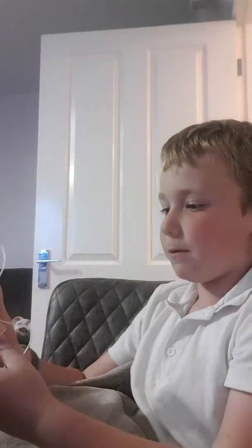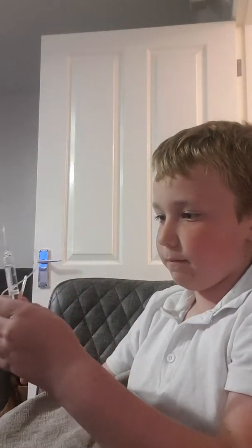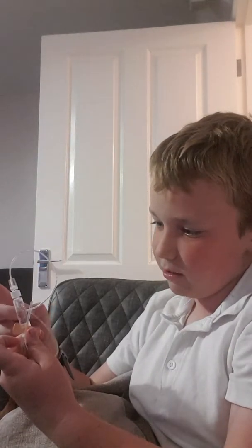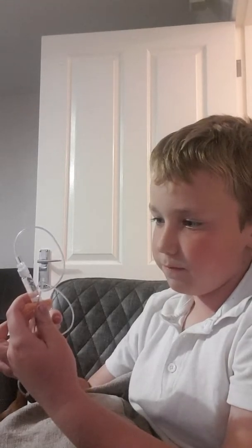Hi guys, today I'm going to be doing my injection because we haven't had it in a couple of days. If you prime the needle, you need to make sure all the bubbles are out. Sometimes you need to flick it to get all the bubbles to the top and get all the air out as well. Don't try this at home.